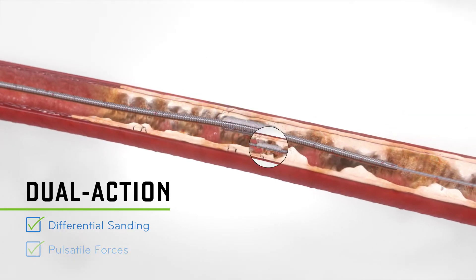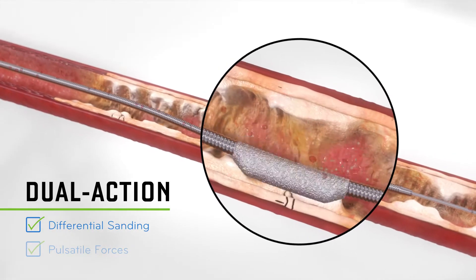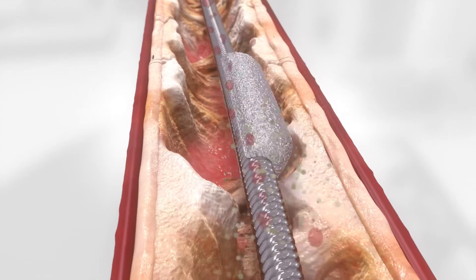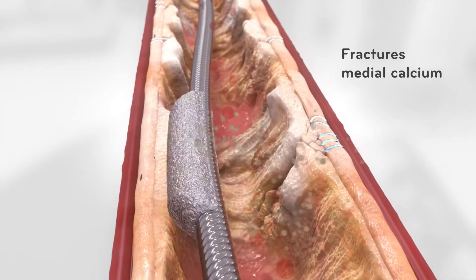Through differential sanding, healthy elastic tissue flexes away from the crown, minimizing damage to the vessel wall. The crown's orbital motion delivers pulsatile forces, and the dual action MOA fractures medial calcium.